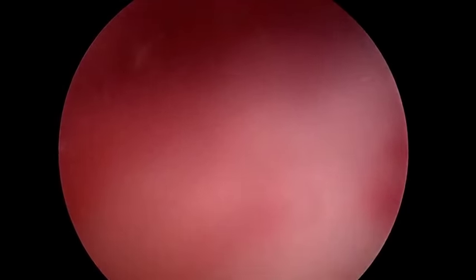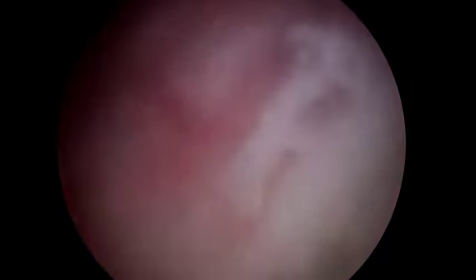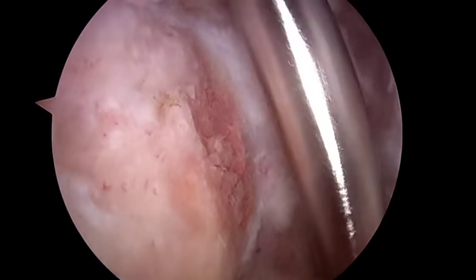And we're getting rid of some more of her scar tissue all the way out lateral so we don't have any lateral impingement or irritation of the rotator cuff. We're going to clean some more of these adhesions out of the way so she's completely free for her rotator cuff to glide. So now we've cleaned out the entire undersurface of the acromion and there's nothing adherent. It's nice and flat.